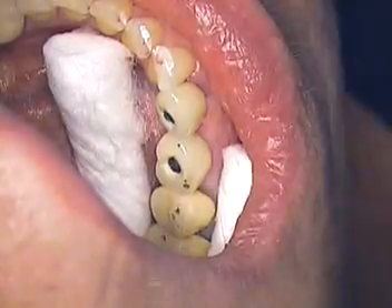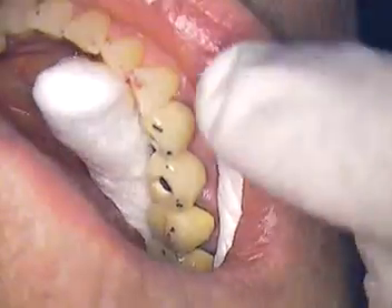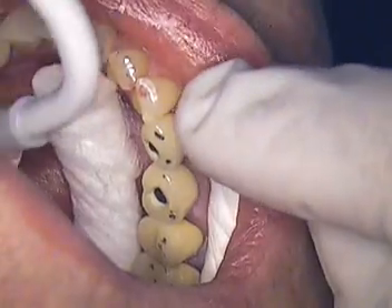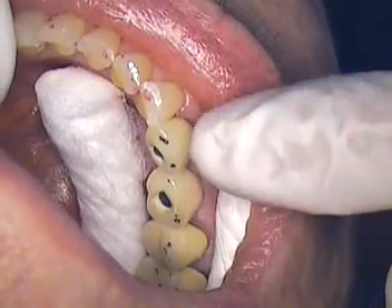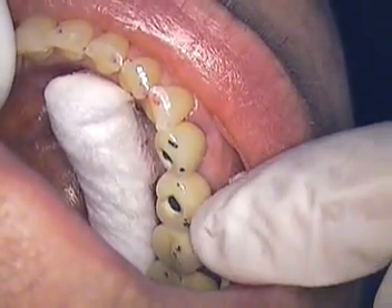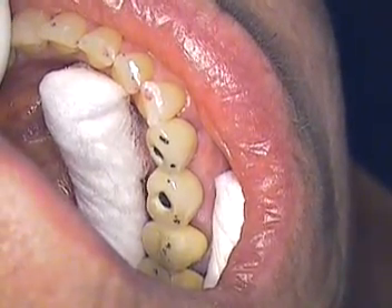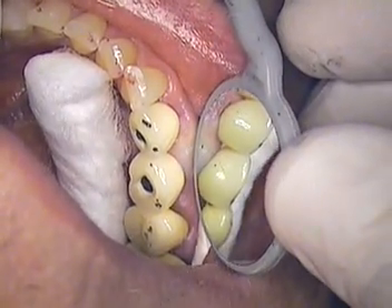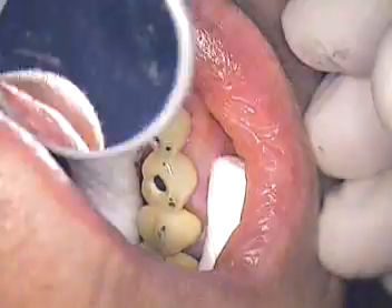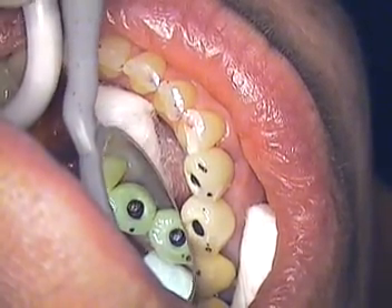Now I'm going to have her bite checked again. Close all the way down and tap. We know one tooth is hitting a little high, right here as we thought before. So now is a good time to adjust that area. After I adjust the bite, I'll take the next segment through adding the little plug. Just to show you again — nice contours on the labial. We try to fill in as much as we can so that food doesn't get caught in between. On the lingual it looks great, and we're ready to insert the plug.